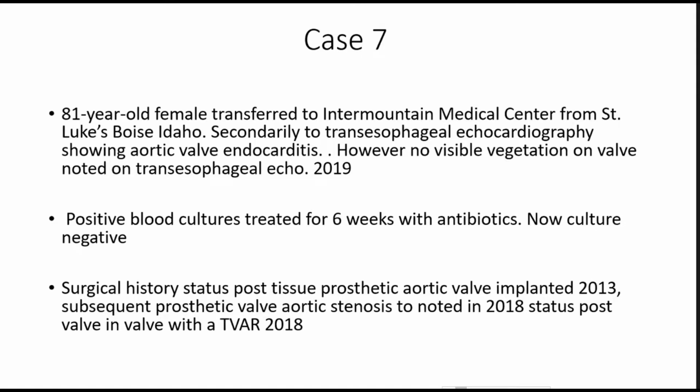So this is an older female who had a tissue aortic valve replacement in 2013, and then subsequently came back in 2018 and got a TAVR due to dysfunction of the 2013 valve, and then in 2019 developed positive blood cultures, had a TEE up in Boise that didn't show any visible or obvious vegetations, and then got sent down for further evaluation.